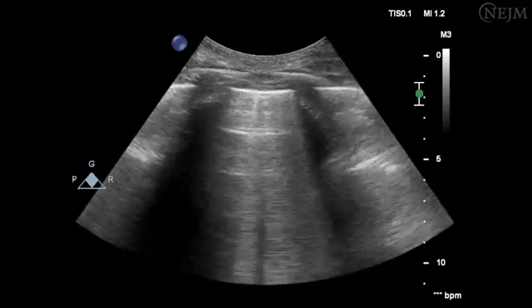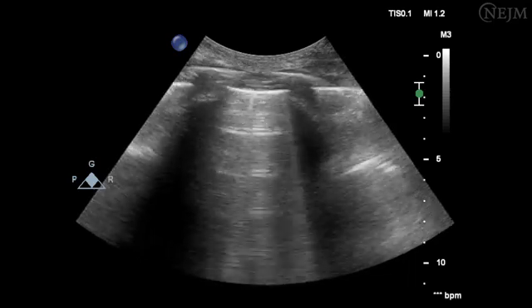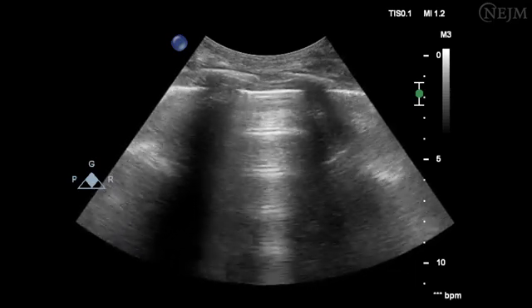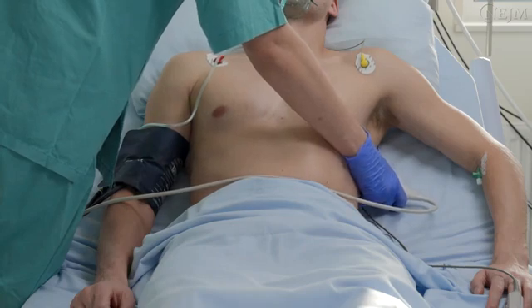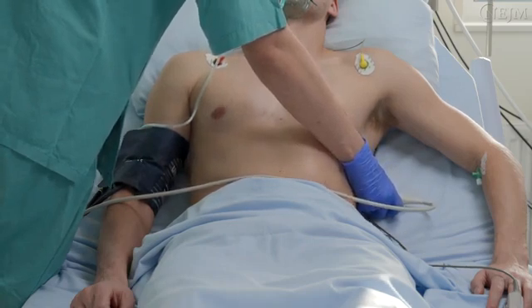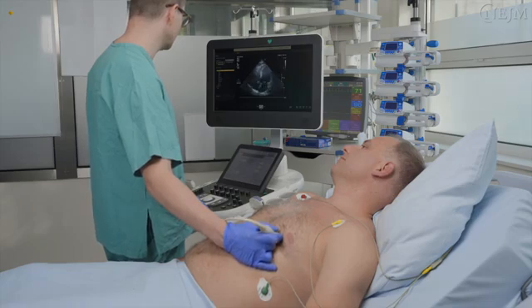The ultrasound image of the lung results from a partial reduction in the ratio of air to fluid, which results in the appearance of B lines. Symmetric involvement of 4 lower chest quadrants indicates an increased amount of extravascular lung water. Echocardiography is indicated to establish a definitive diagnosis.